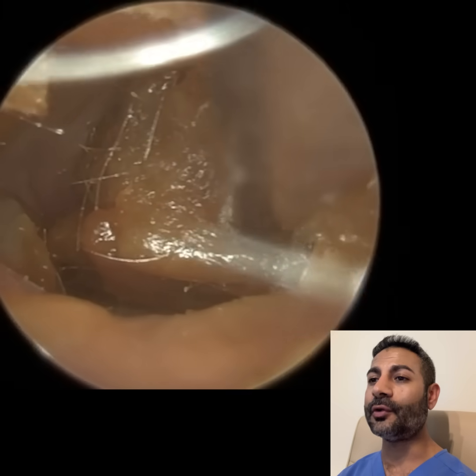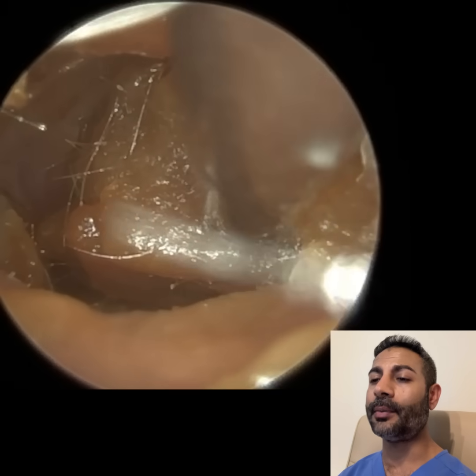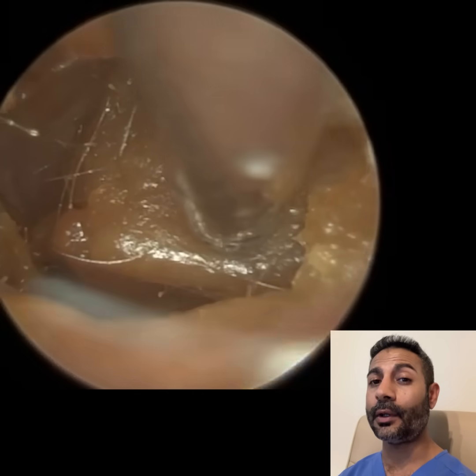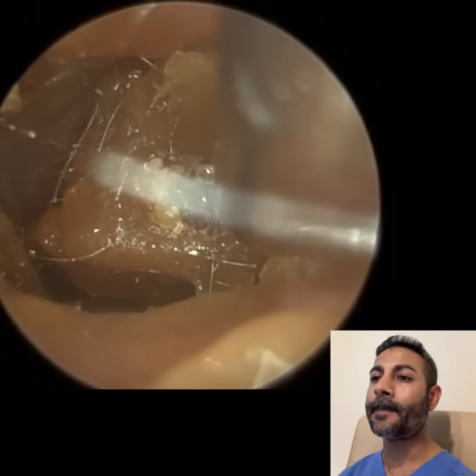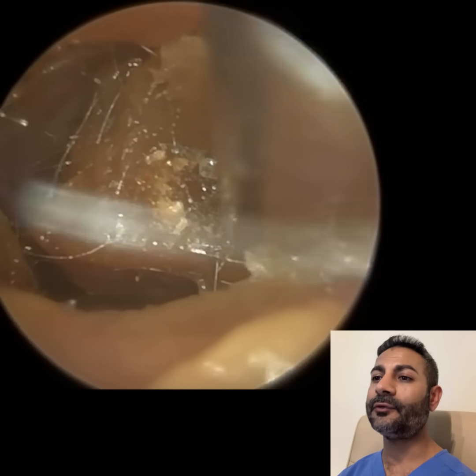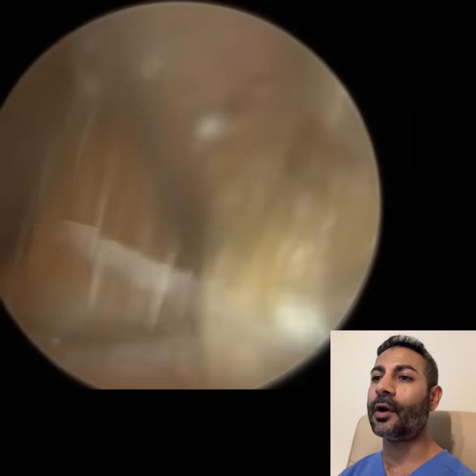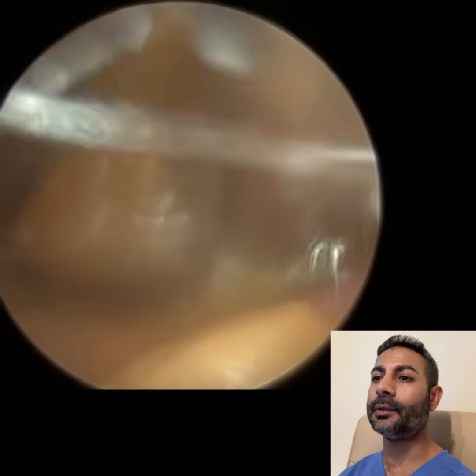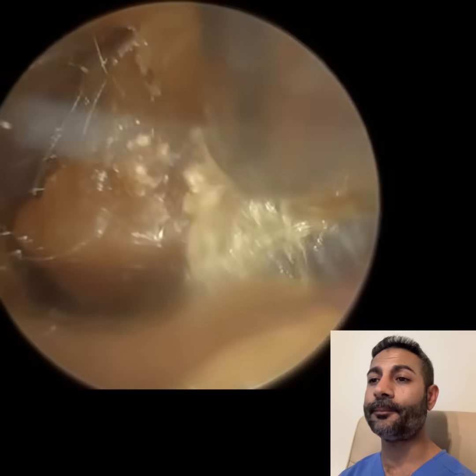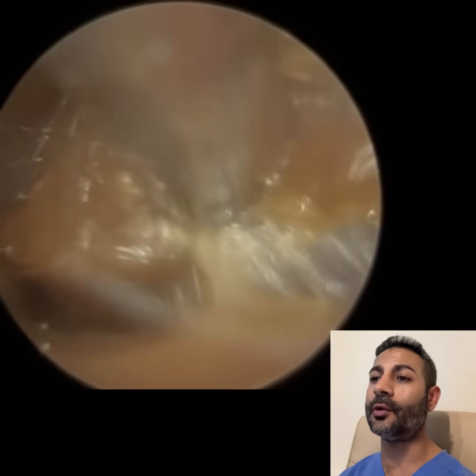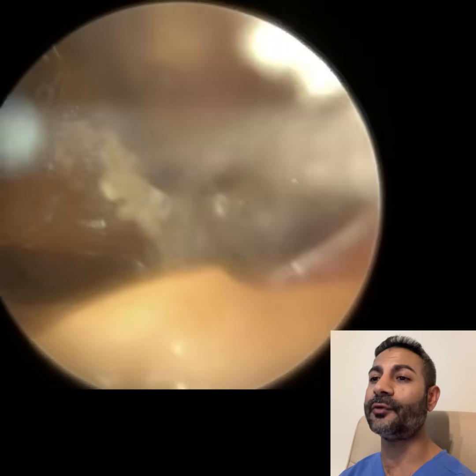This is a patient who attended with bilateral fully occluding earwax. They attend annually and I suspect they've got a very mild case of surfer's ear, also known as exostosis.